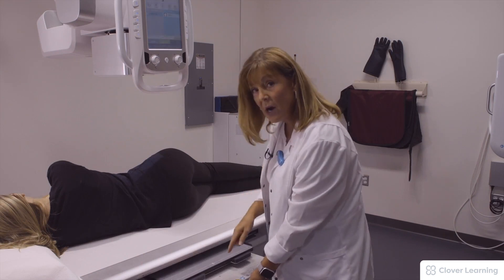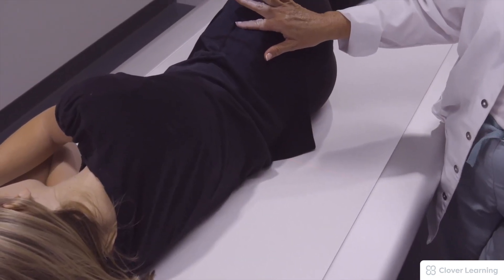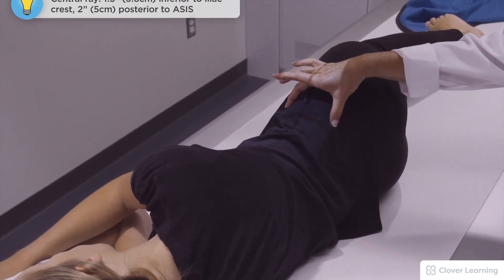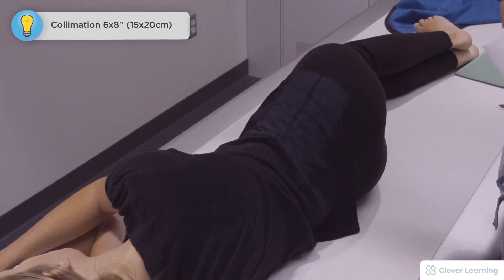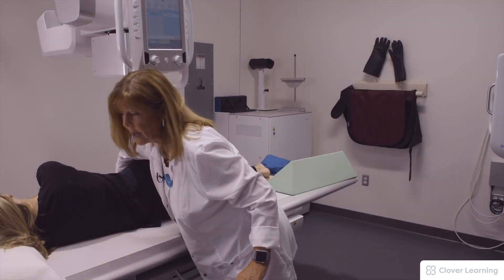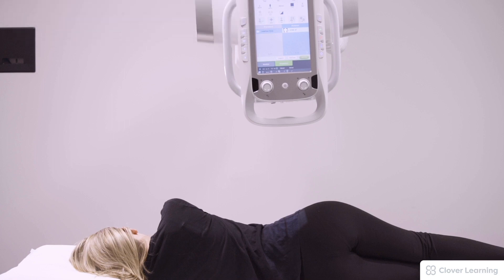Make sure that your IR is still centered after you have applied the angle. Our central ray is an inch and a half inferior to the crest and two inches posterior to the ASIS. It's a tight collimation of that joint space. We're going to use the left marker anteriorly and have the patient exhale and hold very still. Please take in a big deep breath and blow your breath all the way out and hold your breath.